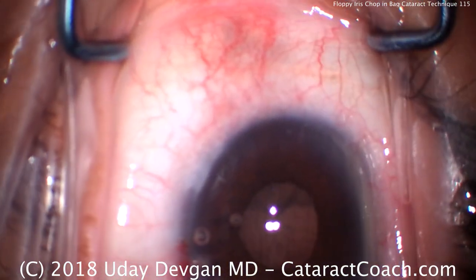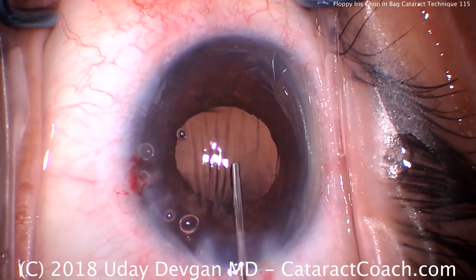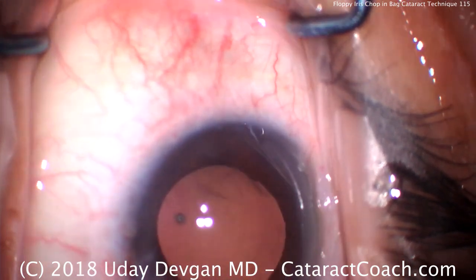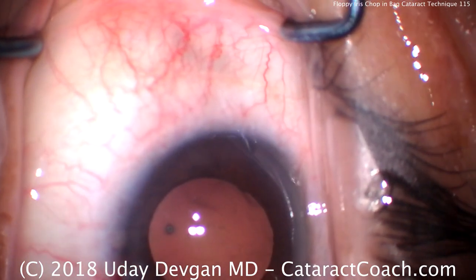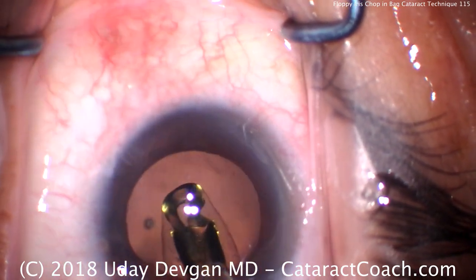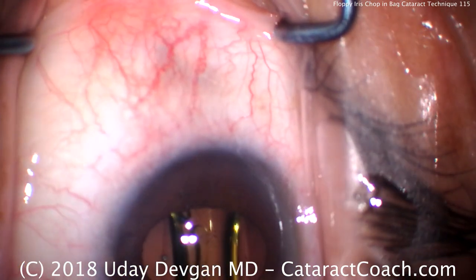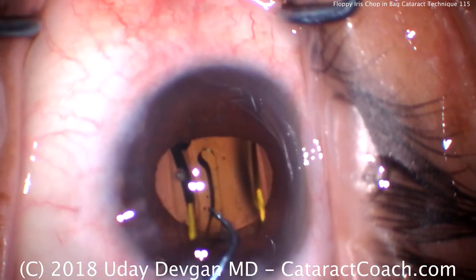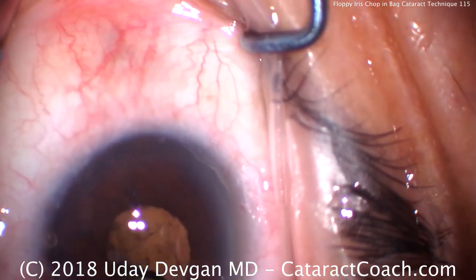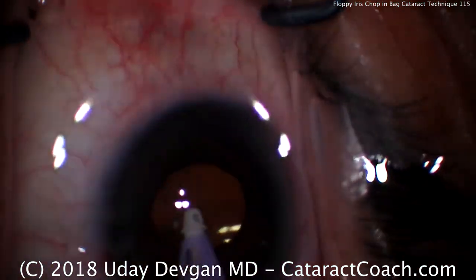Clean up the capsular bag — that looks pretty good. Time to fill up the capsular bag with our cohesive viscoelastic. There's the cohesive filling up the bag, and you can see that also helps to expand the pupil. We can see a little bit of the rexis edge in some areas — that's a nice big expanded pupil. Now, of course, this expansion is only temporary because the viscoelastic is holding it open. Let's get our single-piece acrylic lens loaded into our injector, advance that, and go right in the capsular bag. Leading haptic, optic — there we go. We'll get that trailing haptic in as well, dial that into position, and make sure both haptics and the optic are all completely in the capsular bag. That one sticky haptic will release just like that. You can also tell that the optic has a 6mm diameter — and you can tell how small the pupil is, probably about a 3.5mm pupil now.